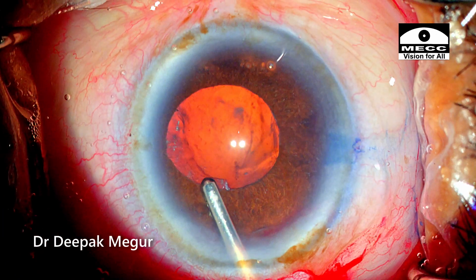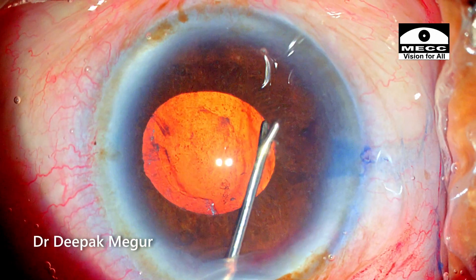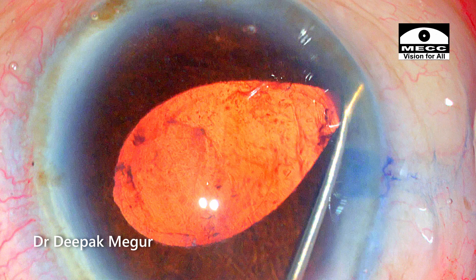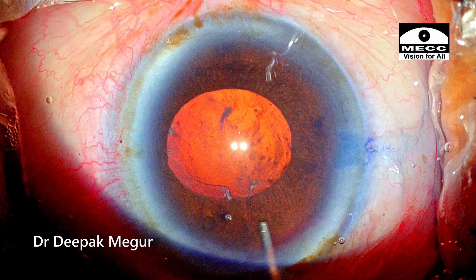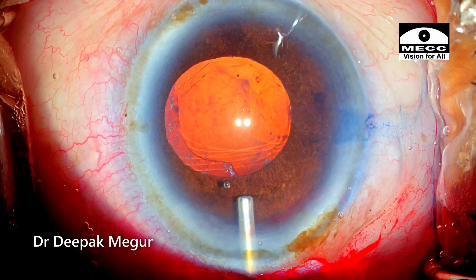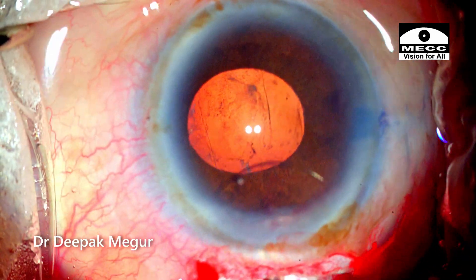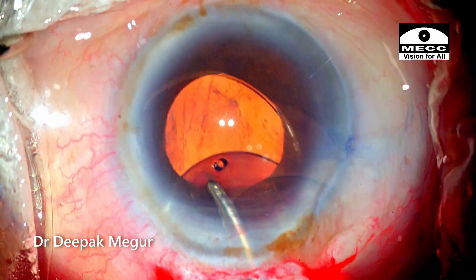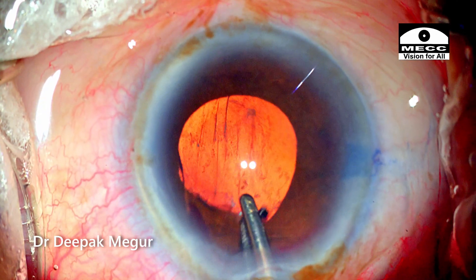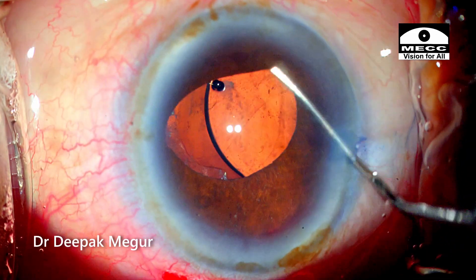I am using gentle irrigation to flush out any remaining fluid cortex. I am using the Y-hook to retract the iris to see whether I can see the edge of the anterior capsule margin in this quadrant — it's not very clear though. The bag is adequately inflated with OVD to ensure that the trauma to the capsule-zonule apparatus is minimized as the lens is being implanted and then dialed into place. This is a PMMA lens with a 6mm optic and a 12.5mm overall diameter. The lens is negotiated into the bag.